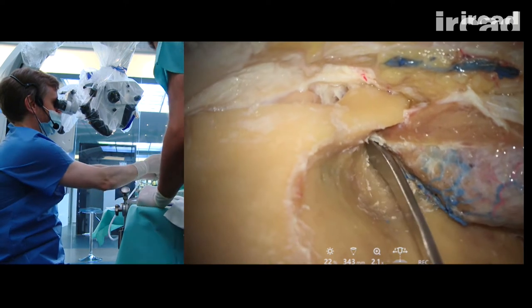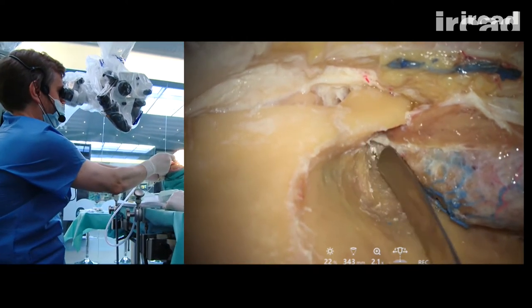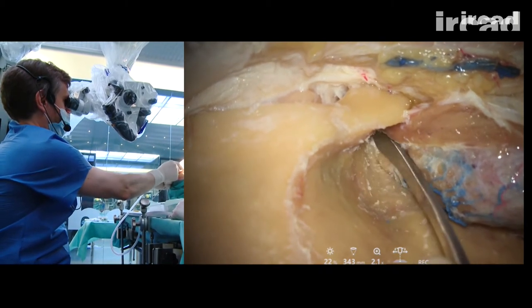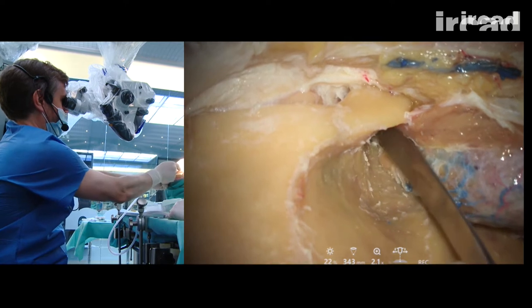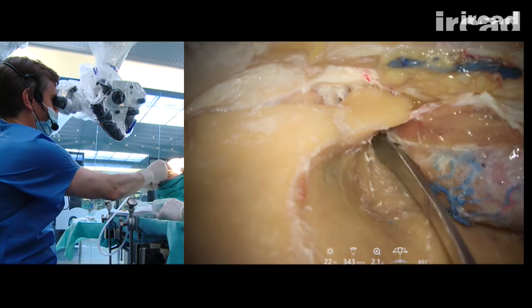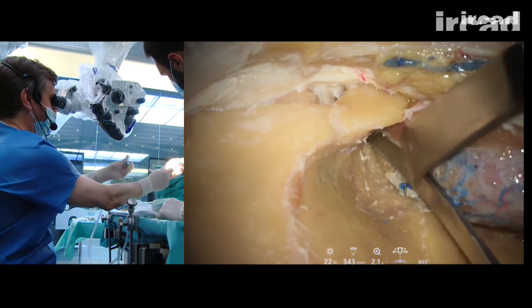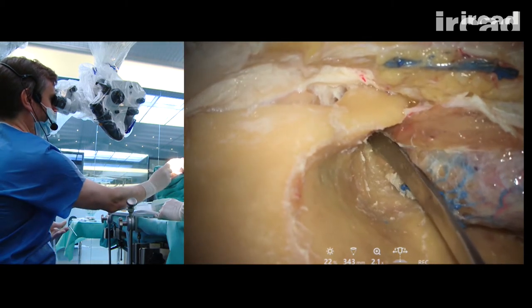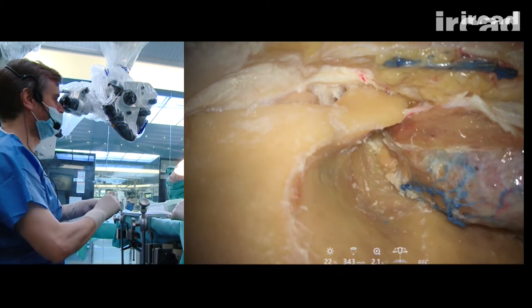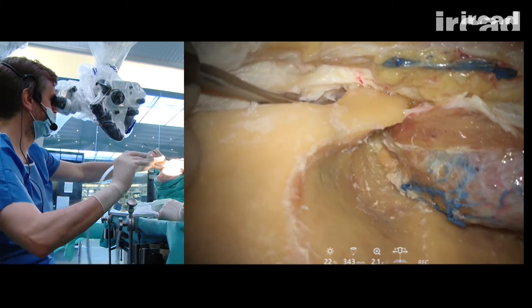So if I move progressively here in the temporal fossa deep, I will get to the lateral aspect of the inferior orbital fissure. I think the defect is here. If I place my dissector on the other side into the orbit, I should be able to see it.